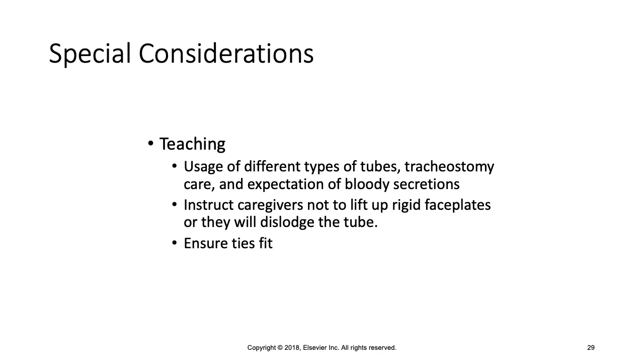A small amount of bloody secretions is something that can be expected with a new tracheostomy tube. A new stoma should have only a small amount. If it's anything more than a small amount, then they need to report that to you, report that to the doctor.